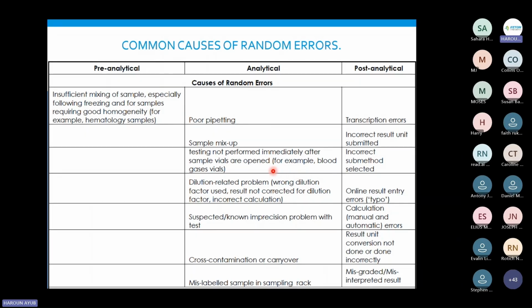For blood samples for EQA for hematology, after you remove it, after 15 minutes, you've mixed it and you are able to run. Ensure that you run it immediately and return it to the 2 to 8 temperature. High temperatures usually cause deterioration. So if you leave it for 2 hours and then you come and run, that can be an issue.